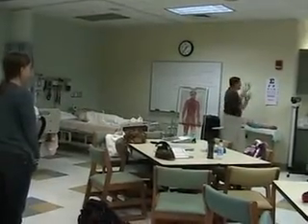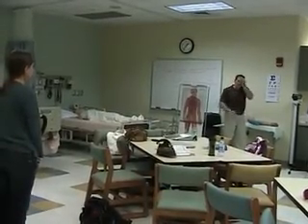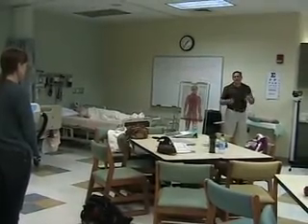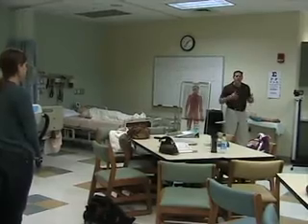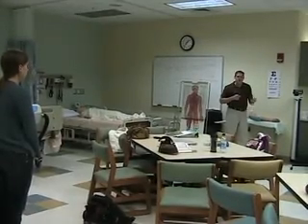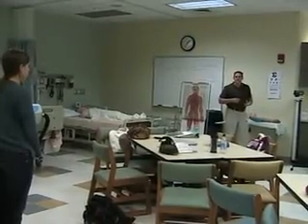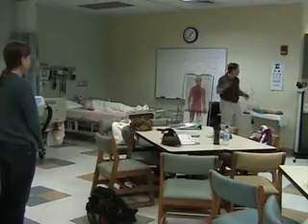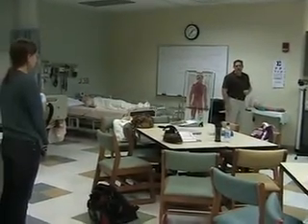What we're going to do with this Snellen eye chart is measure the patient's visual acuity. You can do one eye followed by the other, with contacts or without contacts, with glasses or without glasses. For our purposes, we're going to do corrected vision, which means if they wear glasses or contact lenses, we're going to keep them on. We're going to do both eyes at the same time. I want you to read the smallest line that you can read.